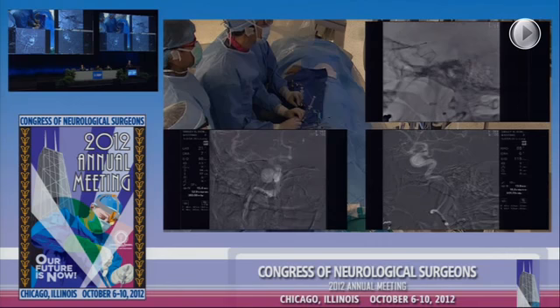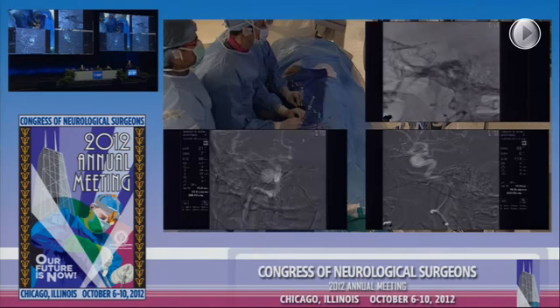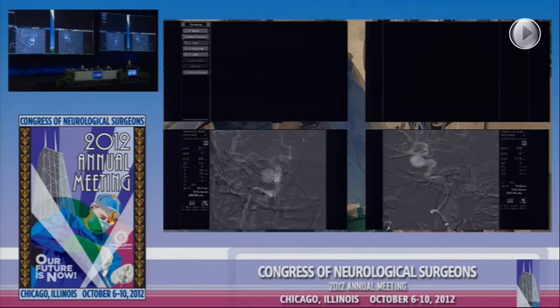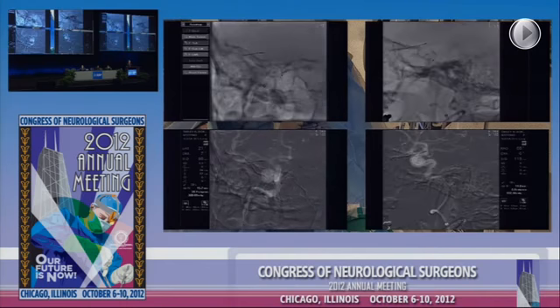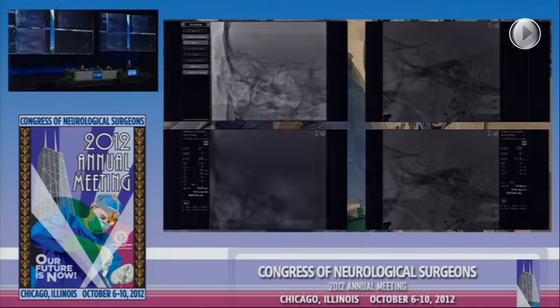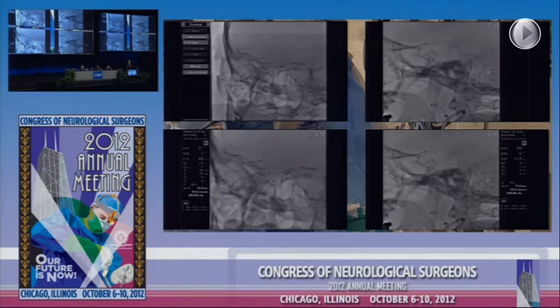Very nice. You can see how it just opened around that paraclinoidal aneurysm. Show the native, the non-subtracted view on the lateral, please. Paul, can you show us the AP view, the native views with all the rest? Just the native views. Oh, nice. Come off roadmap. If you can enlarge those, we can see the stent better. Step off roadmap. There it is. Okay, lateral view.